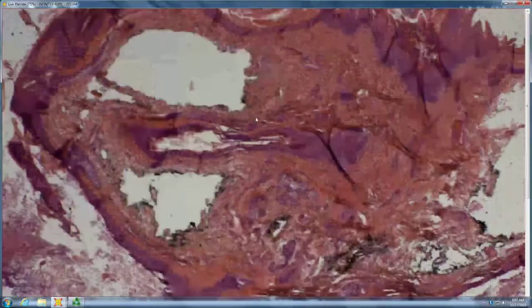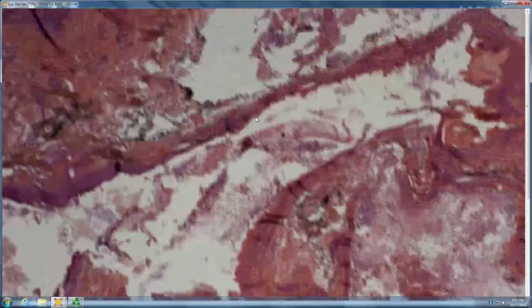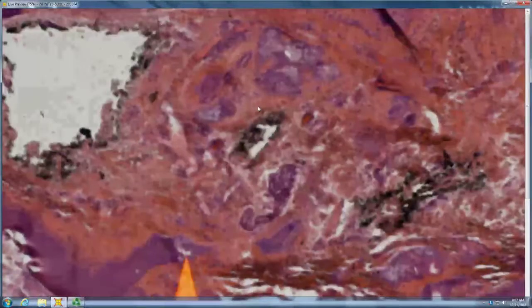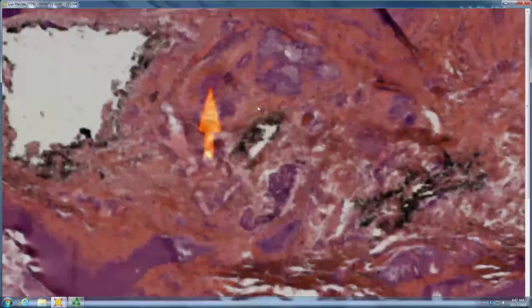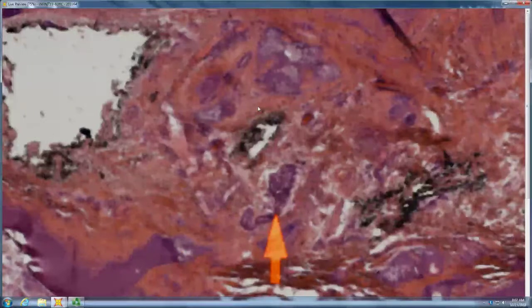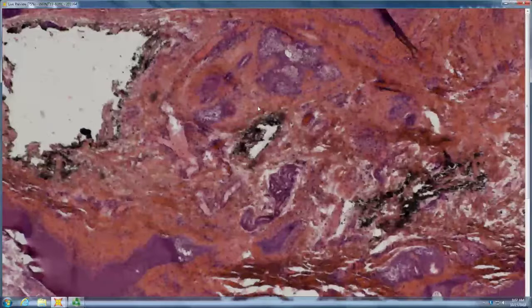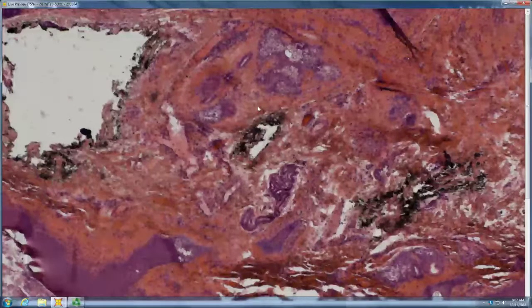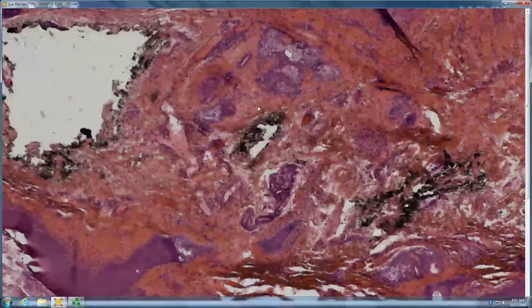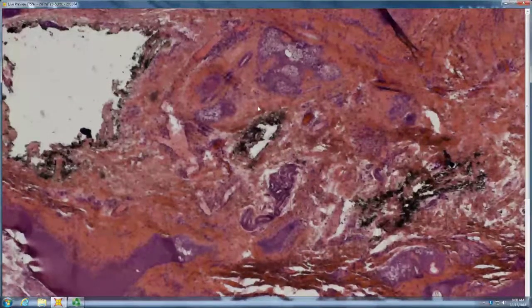We have a lot of debris inside some kind of cystic structure, and then tell me about the wall of the cystic structure. It looks pretty similar to the overlying skin, with hair follicles and eccrine glands. So I'm just thinking of the EIC. Is it a dermoid? It's a dermoid, and if you were playing Jeopardy, you would get credit for phrasing it in the form of a question. So very good.